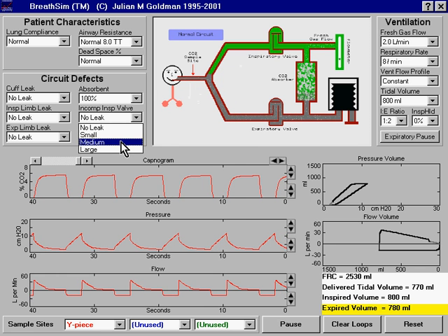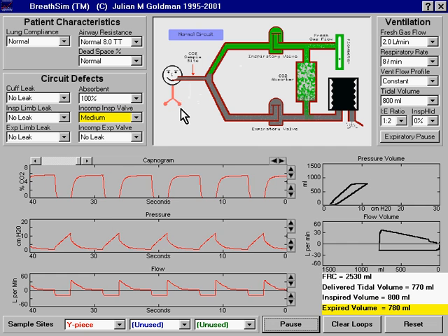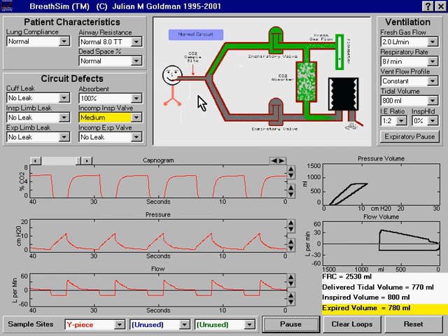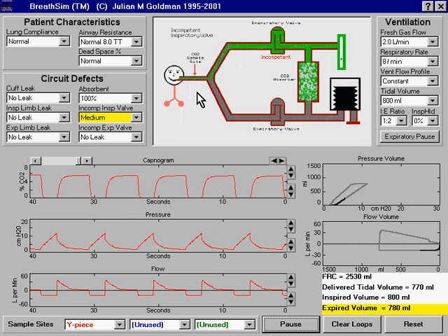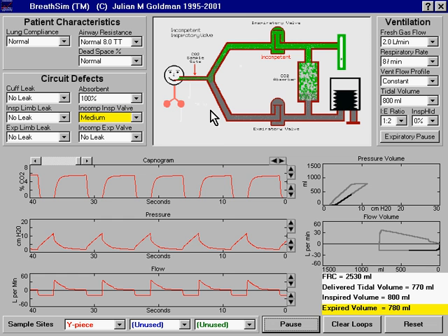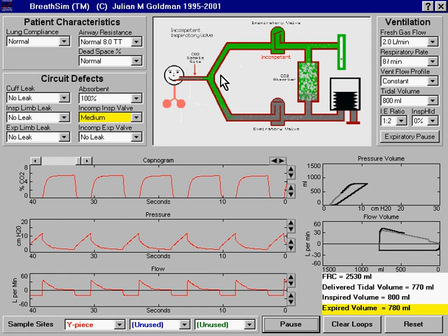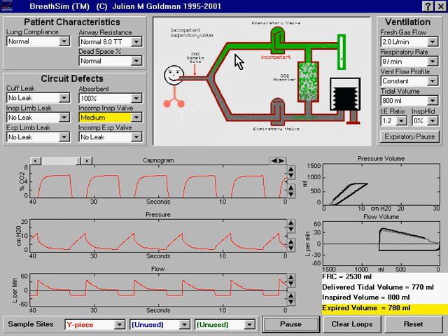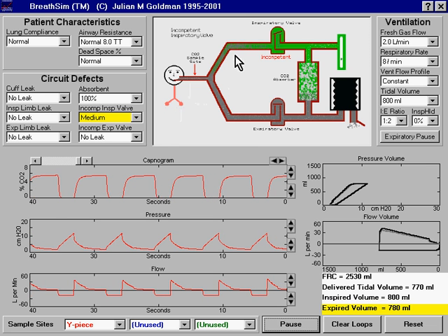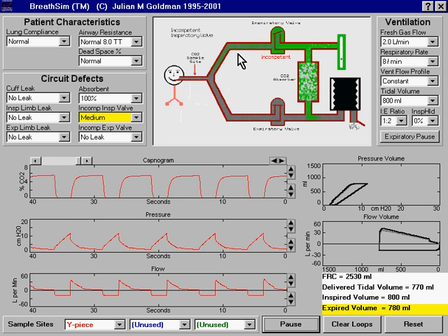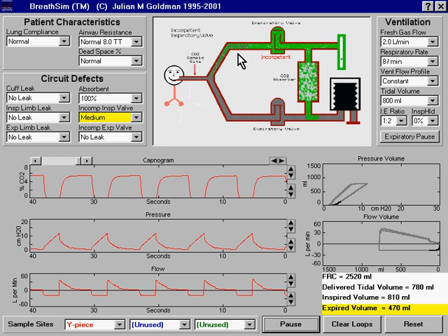When the inspiratory valve is incompetent and the patient exhales, the exhaled volume not only goes down the expiratory limb, it also can go backward up the inspiratory limb. The CO2 sitting in the inspiratory limb is then rebreathed at the beginning of the next breath.